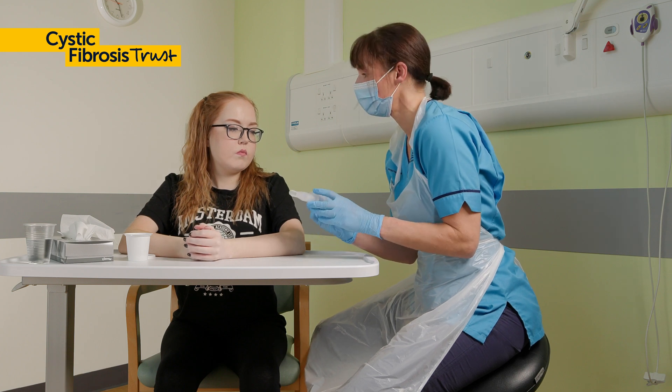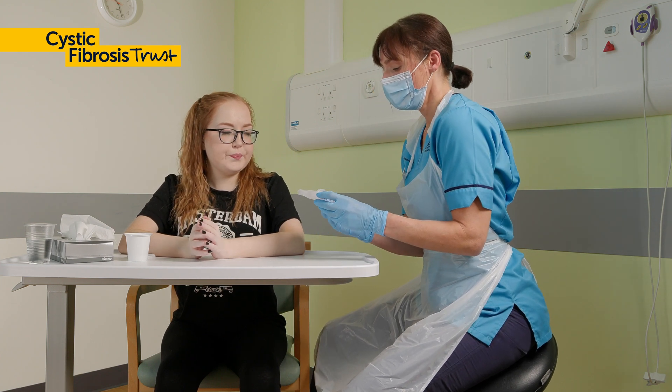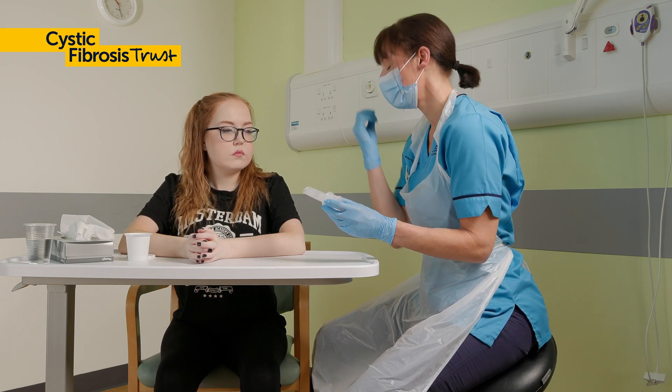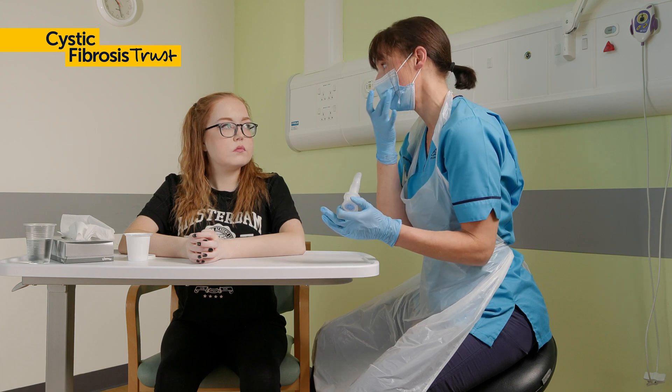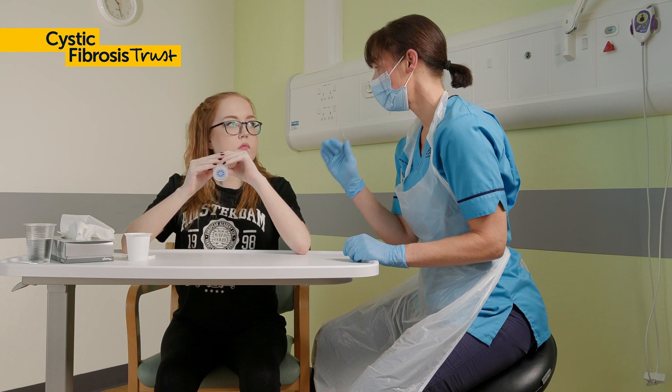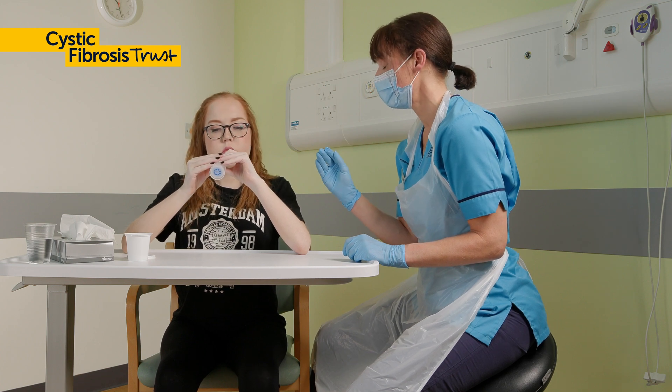Try to keep your cheeks stiff. If you find this hard, use your fingers to press gently on your cheeks to keep them from moving. Start by getting into a comfortable, supported position with your shoulders relaxed and your elbows resting in front of you.